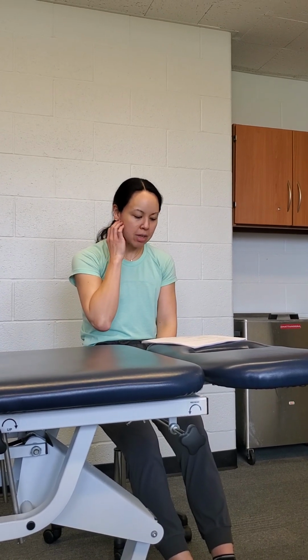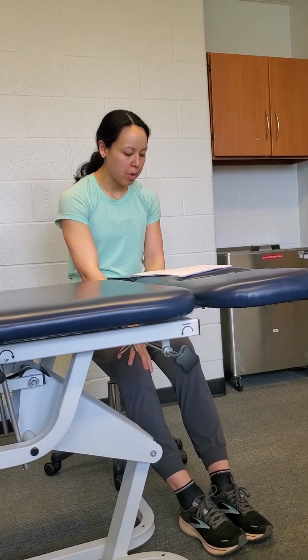For muscle strength and hypertrophy, so we're going to talk about what you are trying to achieve with using the BFR. For lower extremities, the limb occlusion pressure is going to be between 60 and 80%. And for upper, it's a little bit lighter at 50%. And you want to use light loads at about 20 to 30% of their 1 rep max. So we'll talk about how to calculate that, or at least estimate it as a starting point, but certainly you may have to see how the patient's doing with a particular exercise and go down or go up, and we'll talk about that in a moment.